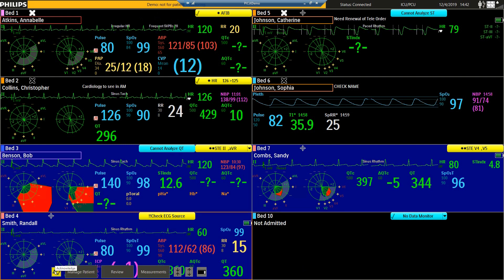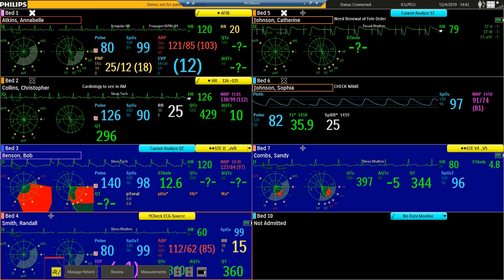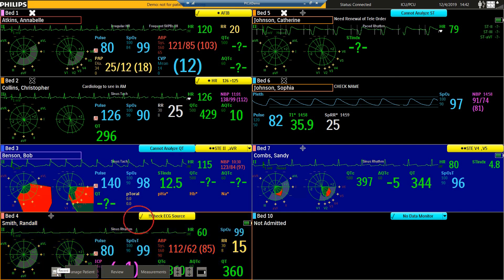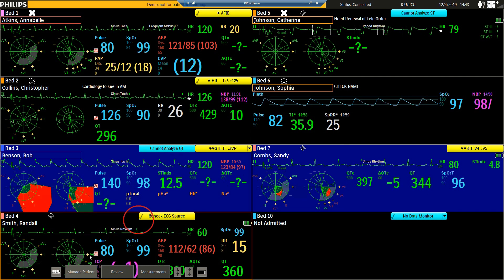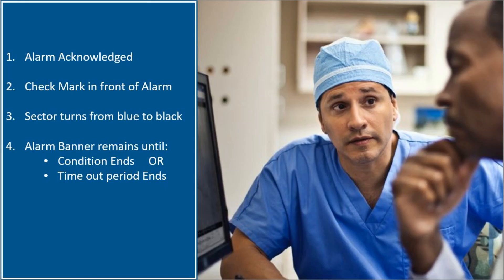To acknowledge this alarm at the Information Center, we select the Acknowledge button. The sector will turn from blue to black and we'll see a check mark next to the alarm indicating it has been acknowledged. However, the banner will remain until the condition ends or the timeout period ends.